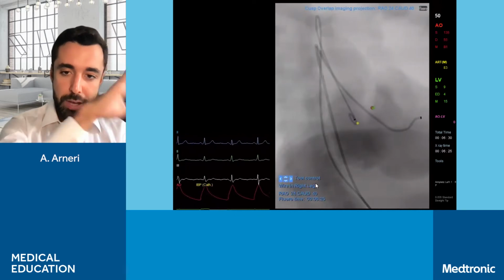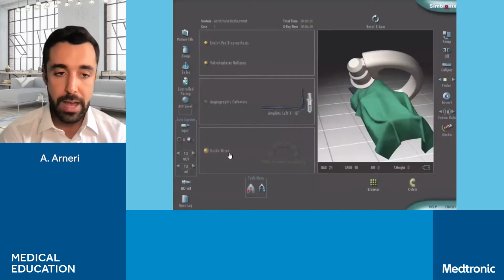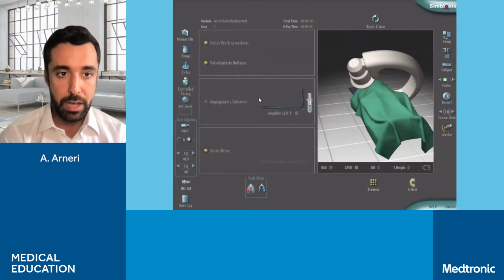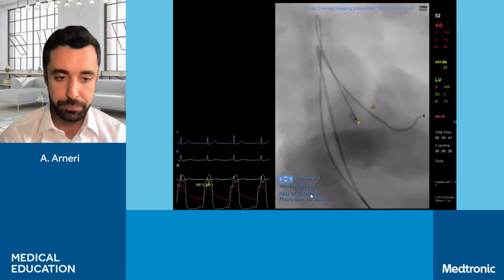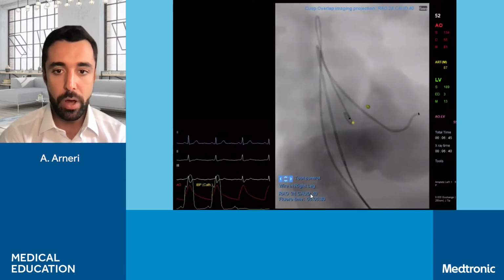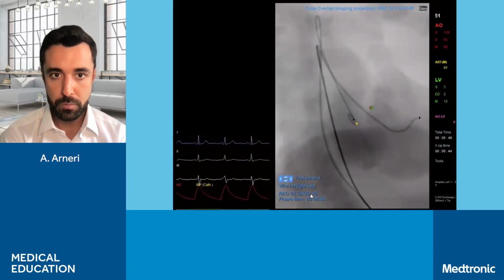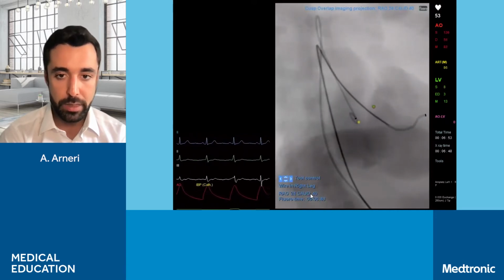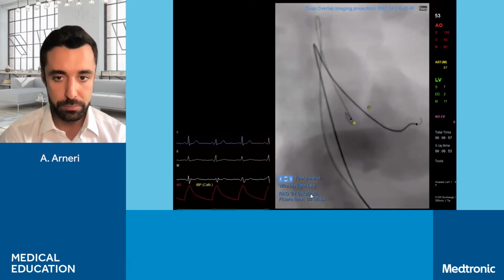So at this point, we have the AL1 catheter into the ventricle, and we have to exchange that catheter with a pigtail. So we take an exchange J-tip wire. We're pushing that into the AL1 catheter. And once the J-tip goes out from the AL1 catheter, we're going to remove that and just keep the wire in the ventricle.